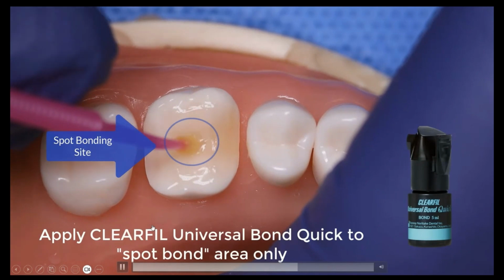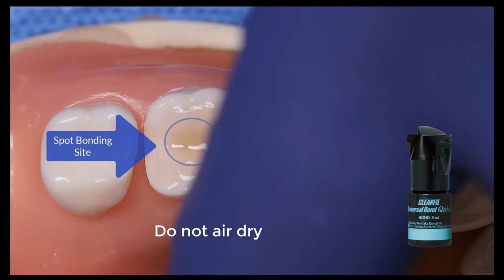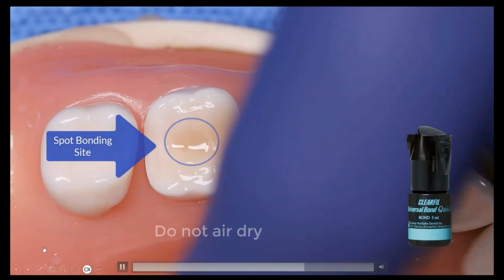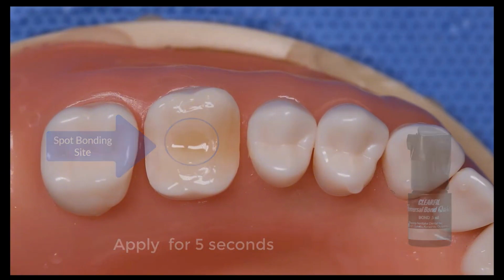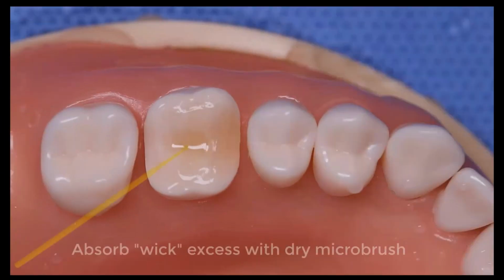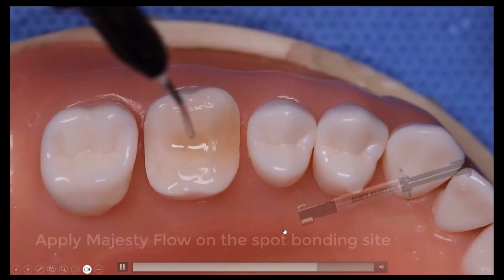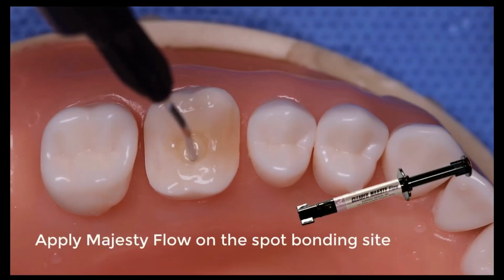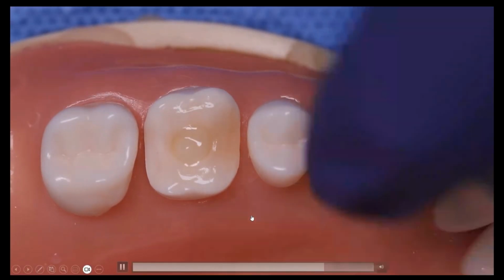I'm going to take my Universal Bond Quick 2, great use for it. Instead of blow drying it, which will mess up everything, I'm just going to wick off the excess. So leave it on for 5 seconds, wick off the excess. And then I'm going to take my temporary after I wick this off. Please don't mock my temporary, but I mean, I can make it look really pretty, but I'm going to put some Majesty Flow. Remember, we talked about any flowable. I'm going to put it on there.